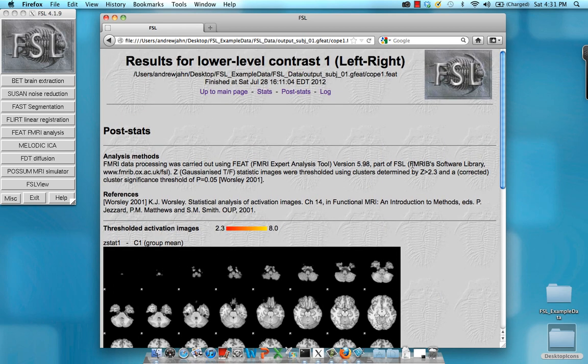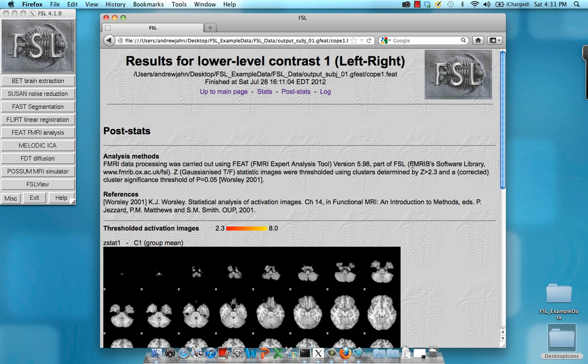Now that we're doing a group analysis, remember that these results are now warped to a normalized space. That wasn't the case doing an analysis at each run, but now that we've combined across runs, we map those results onto a standardized template.